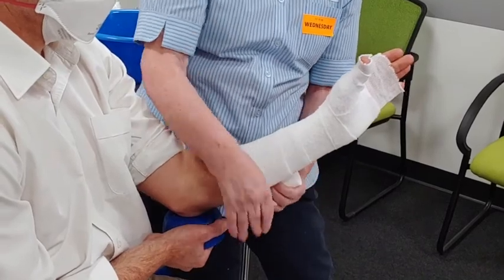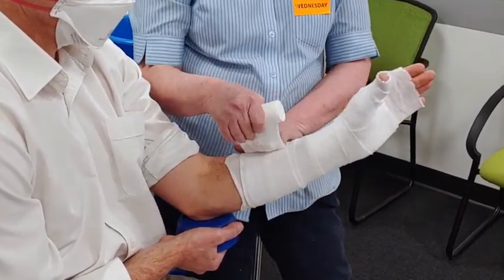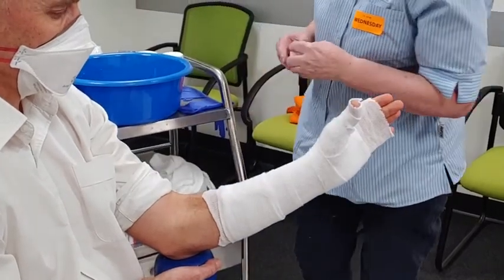Not too much tension — the tighter you pull, the thinner it becomes. Go around twice at the bottom: two passes is standard for that.